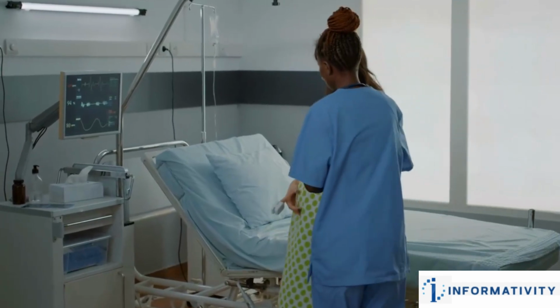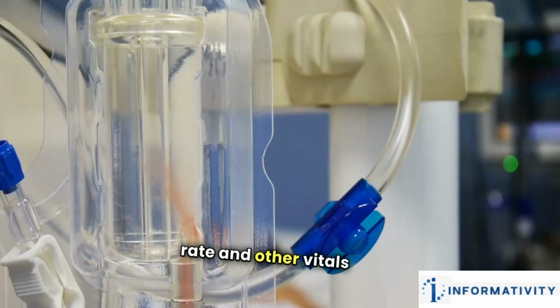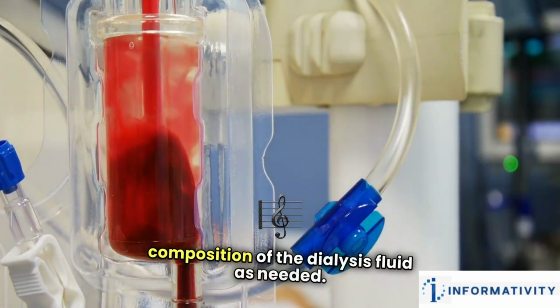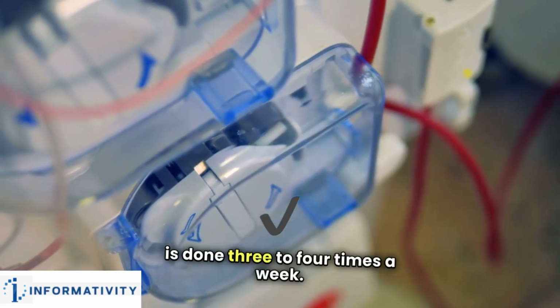Monitoring is crucial throughout the procedure, as the patient's blood pressure, heart rate, and other vitals are monitored. Adjustments are made to the flow and composition of the dialysis fluid as needed. Each session typically lasts 3 to 5 hours and is done 3 to 4 times a week.